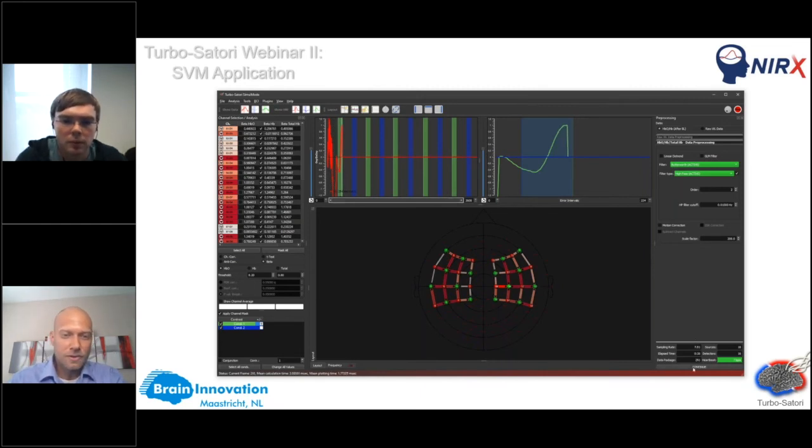The second question: is there an LSL stream into Turbo-Satori to catch the stimulus timing in real time, or does this have to be predefined? So the LSL stream is not available from Turbo-Satori.